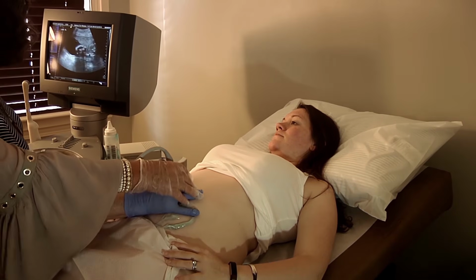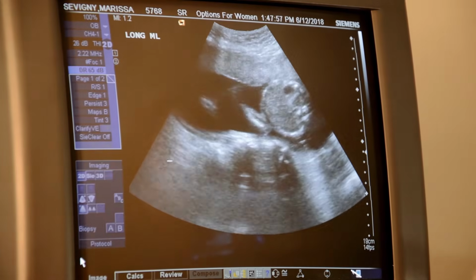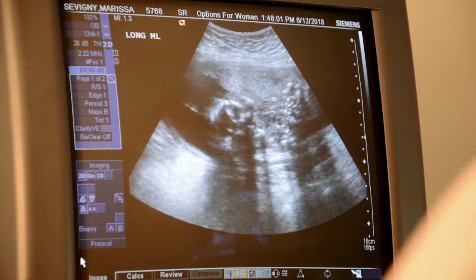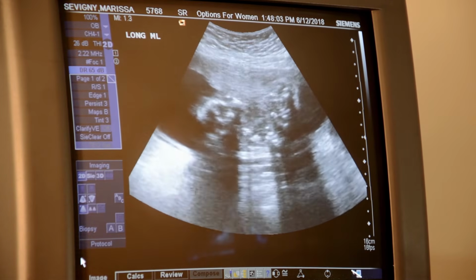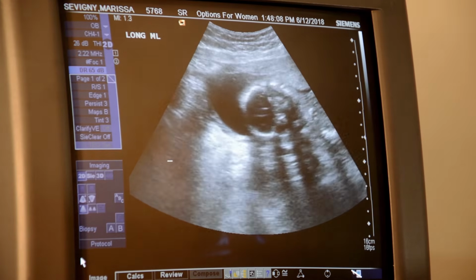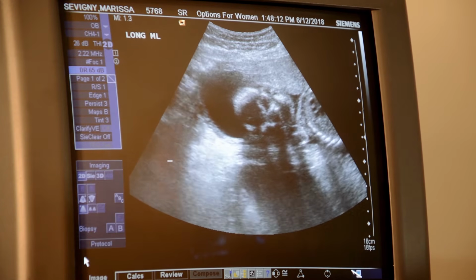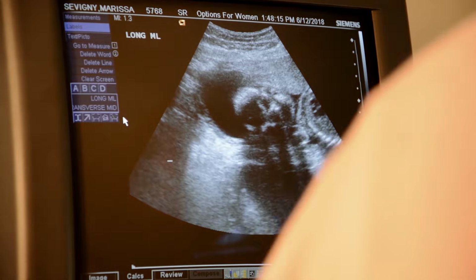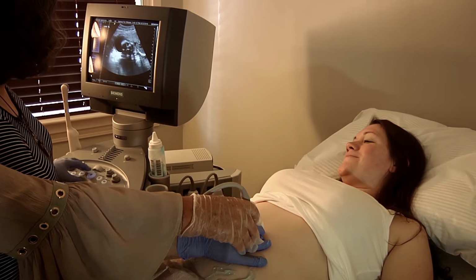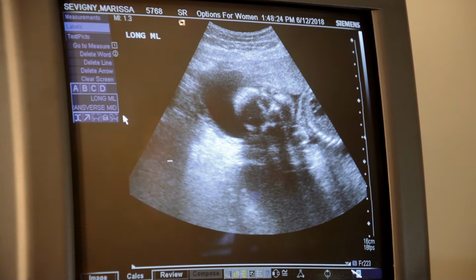And I want you to freeze that. Should I make the depth down a little bit? Yeah, that looks good. No, up a little bit. Okay, good. And then, nope, just drive up a little bit further to the fundus. There you go. And then you can freeze right there. You get the baby's face there too. Freeze. Okay, so the top of the fundus is right here.